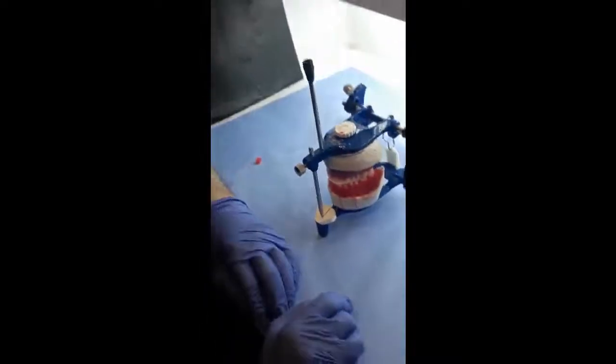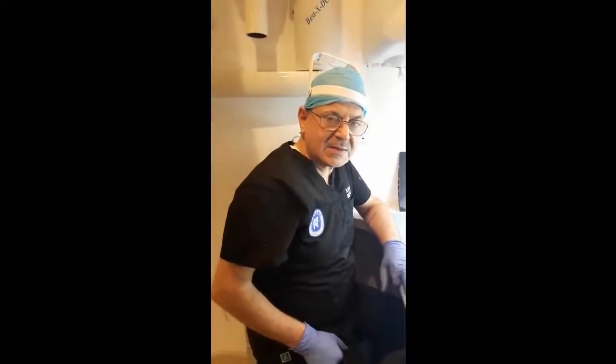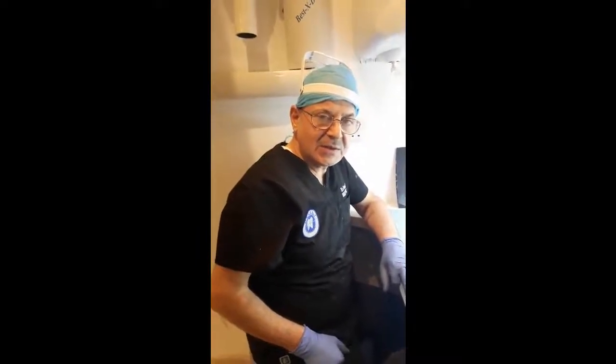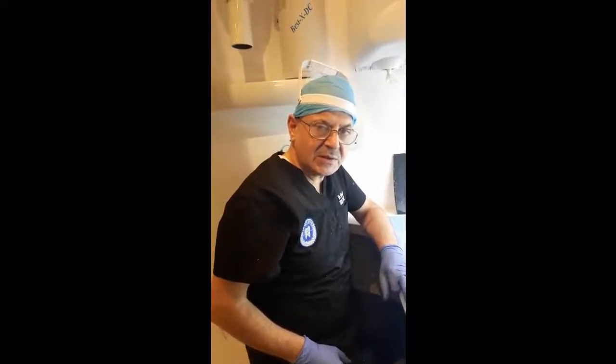Now, by this we have completed the arrangement of all the teeth. The next demonstration will be the waxing up and festooning in order to produce the polished surface of the complete denture.